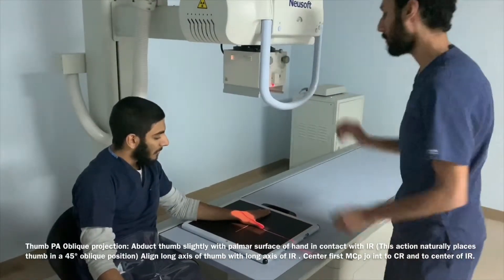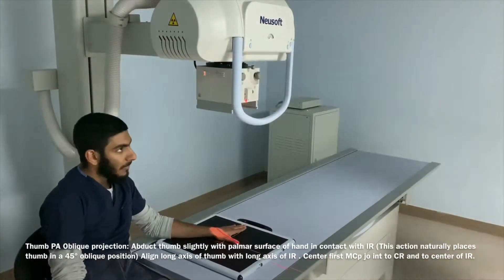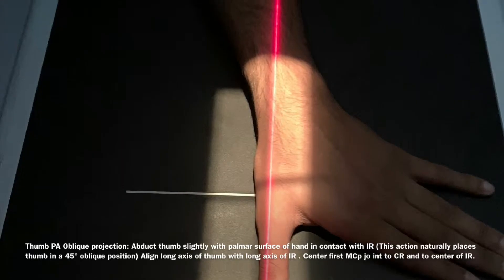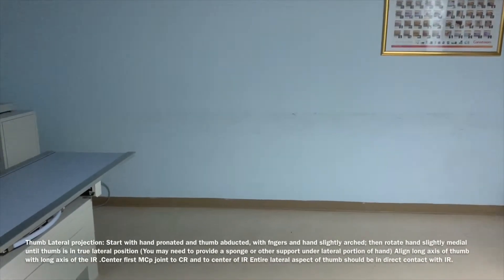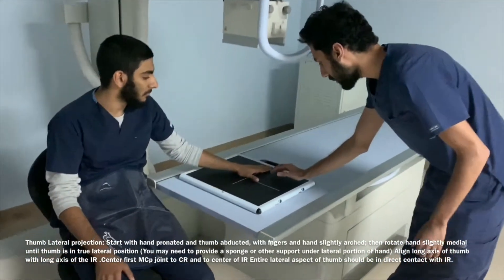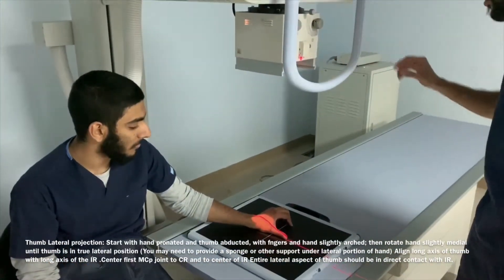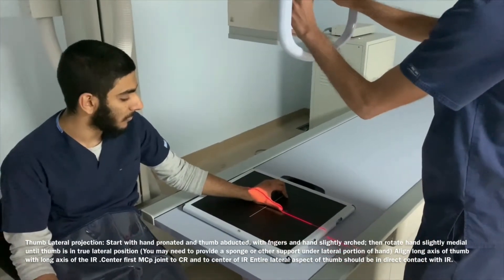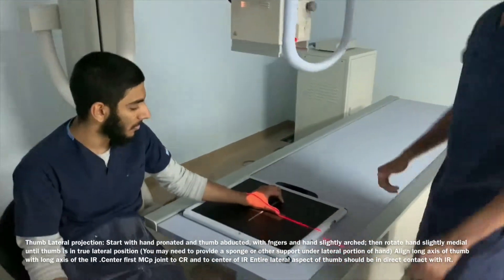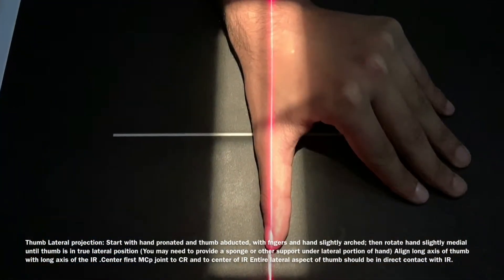Note that the central ray shoots directly at the first metacarpophalangeal joint. Here's a clear view of the PA oblique position. Moving on to a true lateral projection, making sure the lateral border of the thumb makes true contact with the image receptor. This is a clear view of the lateral projection right there.